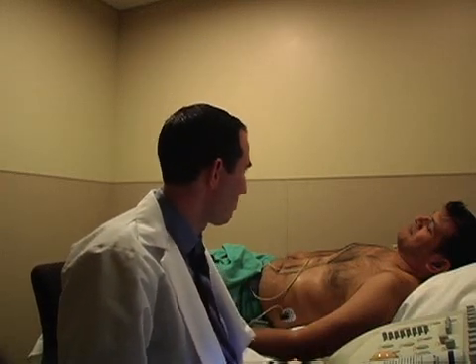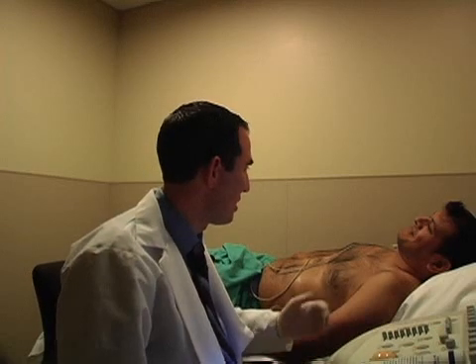Whenever we start an echocardiogram, you always want to make sure we identify the patient with two identifiers: name, birth date, and medical record number. Hello, my name is Ray. I'm here to do your echo. What's your name and birth date?